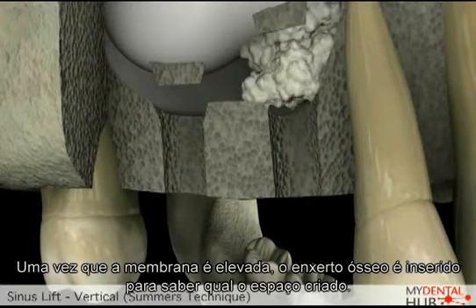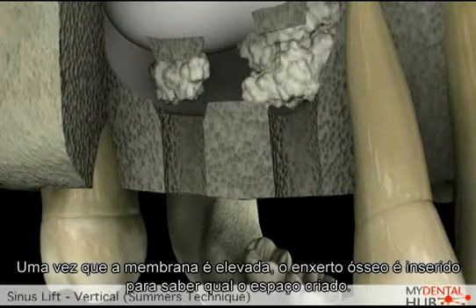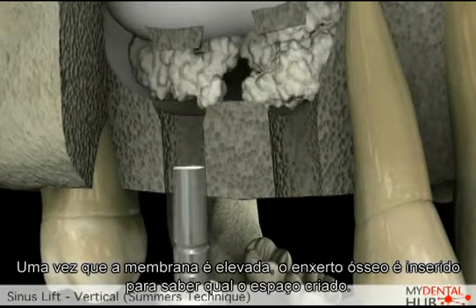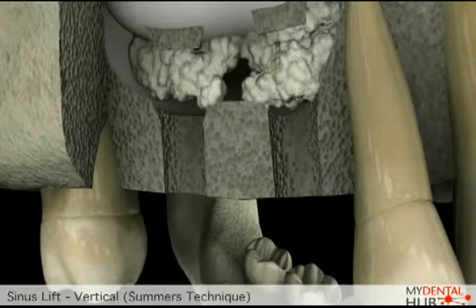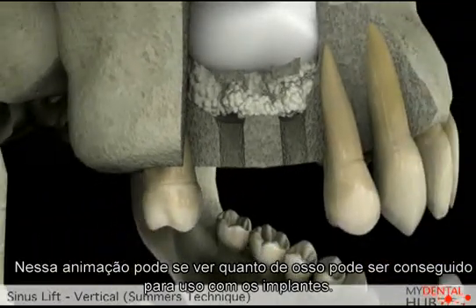Once the sinus has been lifted, bone grafting material is placed underneath the sinus and bone to fill the space which is now created. From this animation, you can see how we can lift the sinus further and create more bone for our implants.